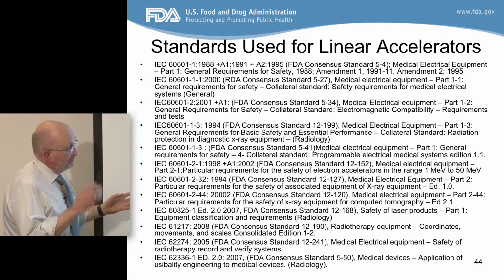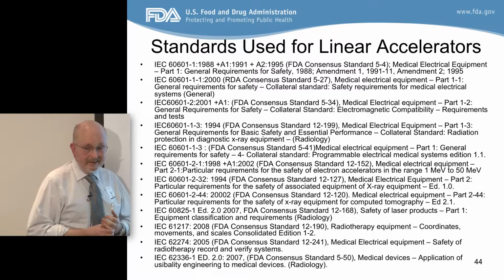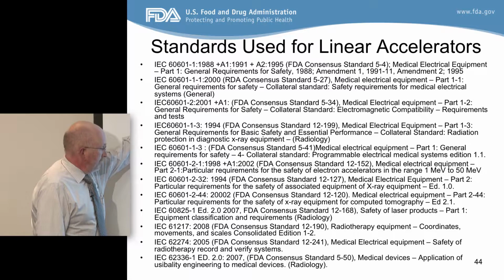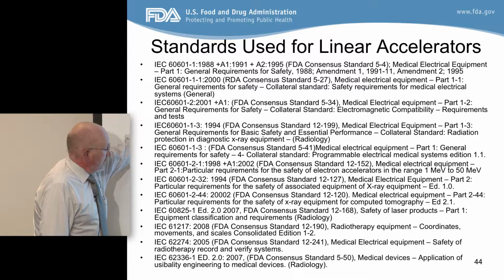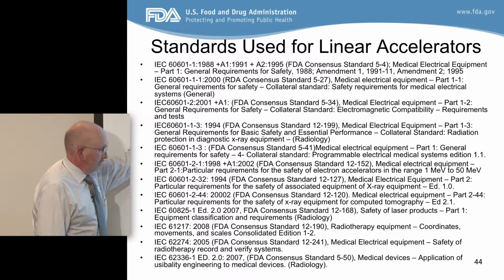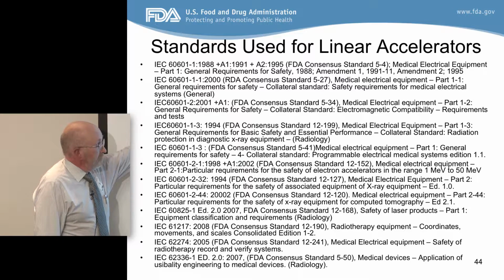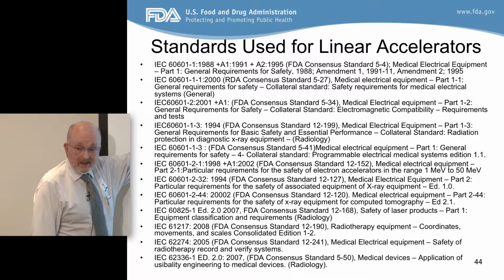Now this is a test of your eyesight. I just thought another issue that we deal with quite a bit with linear accelerators, we try to acknowledge as many standards as possible.